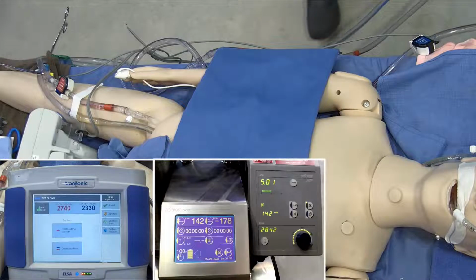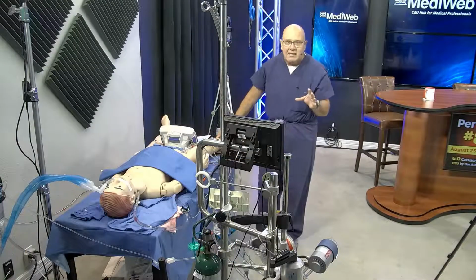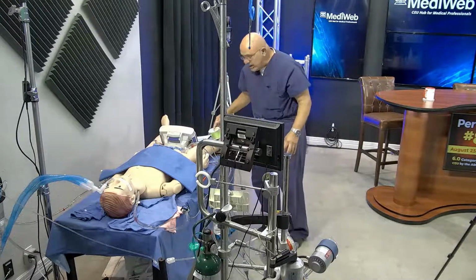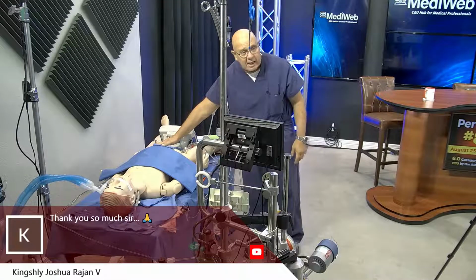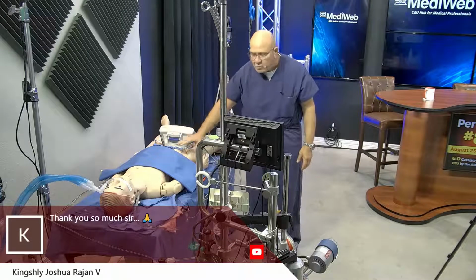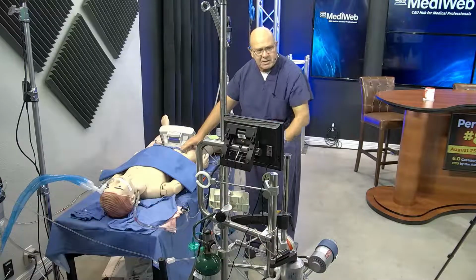So let's go to camera 4. So at the end of the day, where the resistance really is in the access at this point in time, that's our limiter. And we can add another access line and wire those together too, but we're not going to do that today. Can you go ahead and put that multi-pack, not the 3 things that we just did again?